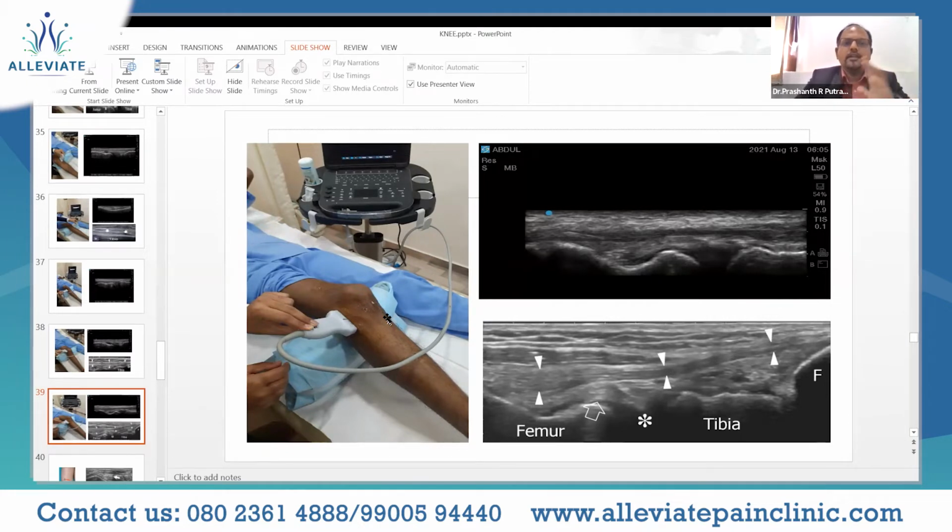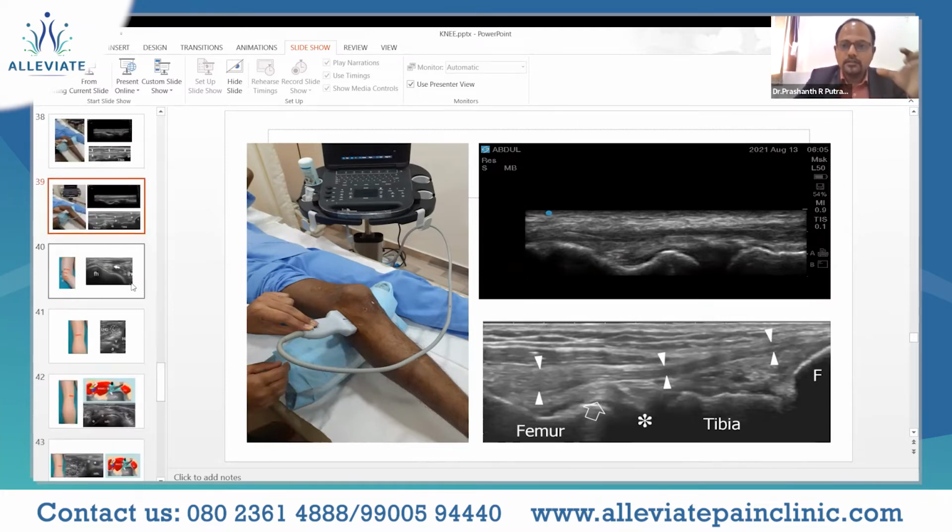While doing any ultrasound scan, the parts to be kept in mind are the pressure, the alignment, the rotation, and the tilting. Adequate pressure has to be maintained because this is a very superficial scan while scanning the knee, and the bursae are located superficially. If you apply too much pressure, that can dislodge the fluid in the bursa, and you may not be able to visualize the bursa itself with the fluid. So keep that in mind and apply an adequate amount of pressure, and a lot of jelly would help, because then you would not require a lot of pressure.